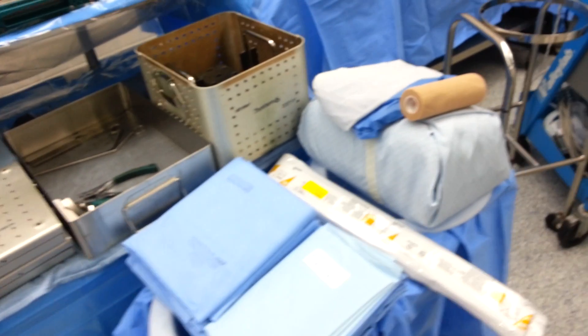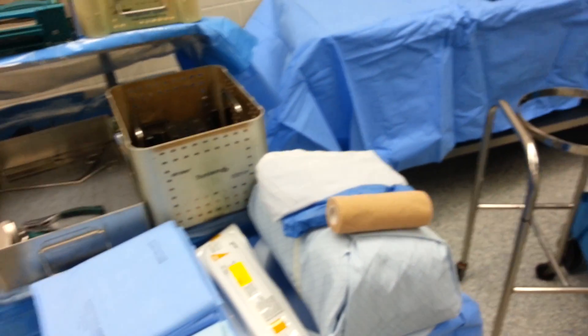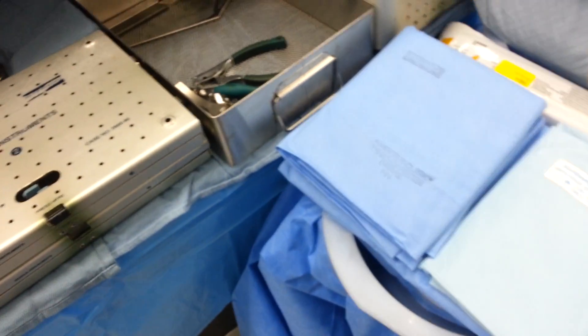We have our drape stuff here. Everybody drapes differently — this is not all of our drapes, this is just what came in the pack that we opened for this demo. And some c-section towels, stockinette, Coban, and Ioban.